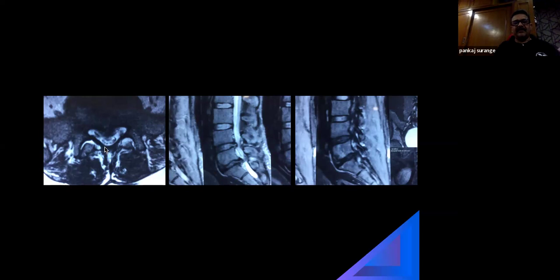In this case, we can avoid a major surgery. We can just go inside. These are all actual patients where we did just this. You can see the cyst over there. We just remove the flavum. No, sorry, this one, the aspiration. That's it. And the patient had absolute relief.